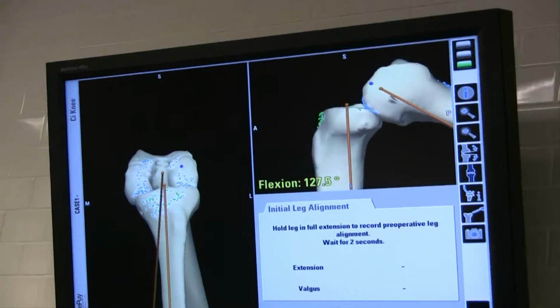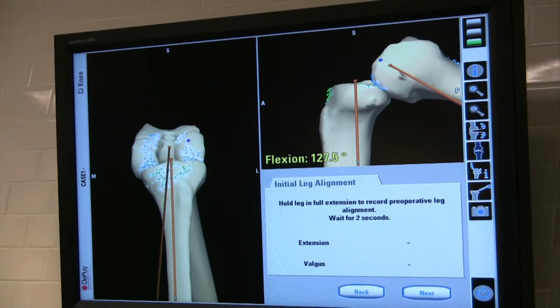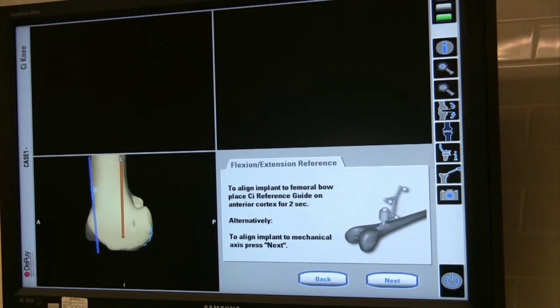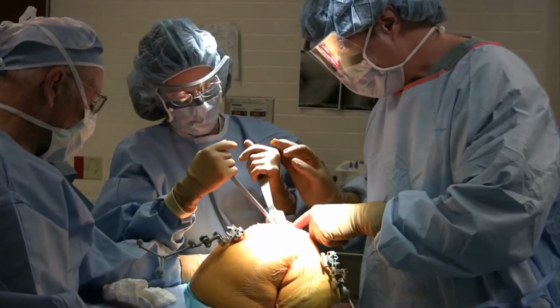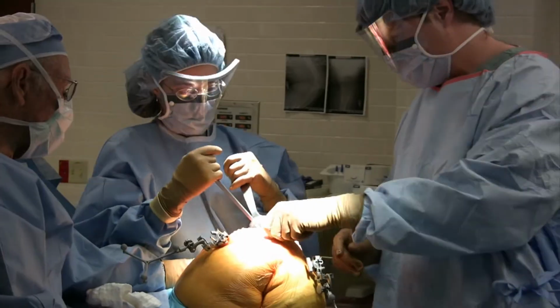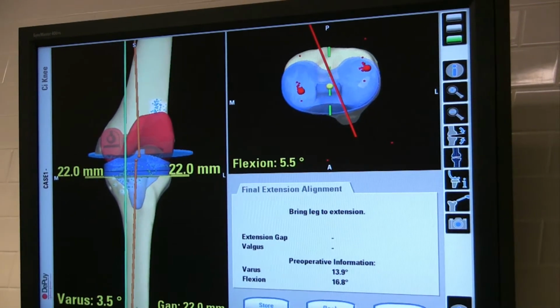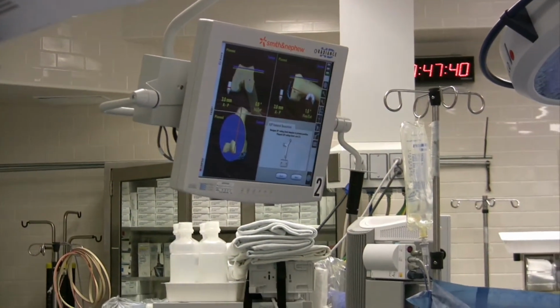Essentially what you do is, first of all, it's been proven that our eyes can't tell the difference between, like, about a 10-degree angle in surgery. So what they're doing is they're putting this rod up the thigh bone and hoping to cut the bone between a 5 and 7-degree angle. Sometimes you get it, sometimes you don't. But really, if you're trying to do that, then it doesn't necessarily do that. Now we have this new technology to assist in surgery, computers.